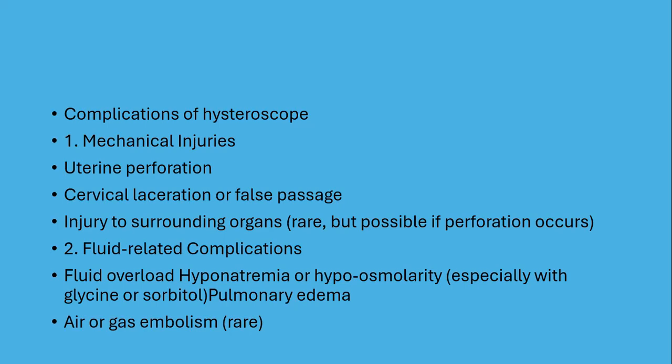Complications of hysteroscope. 1. Mechanical injuries. Uterine perforation. Cervical laceration or false passage. Injury to surrounding organs, rare, but possible if perforation occurs. 2. Fluid-related complications. Fluid overload, hyponatremia or hypoosmolarity, especially with glycine or sorbitol, pulmonary edema. Air or gas embolism, rare.